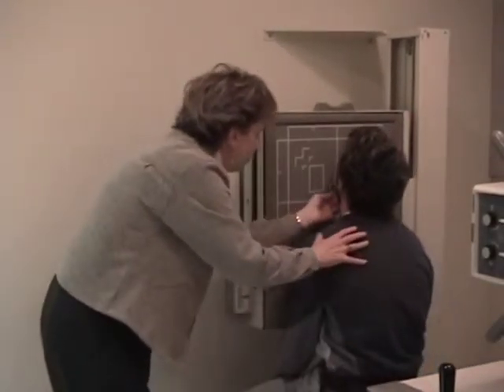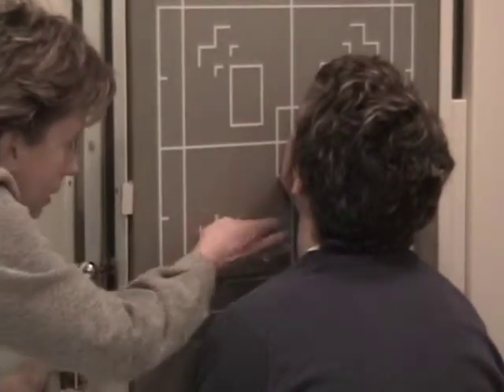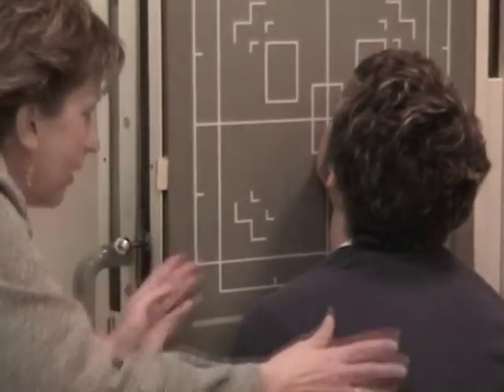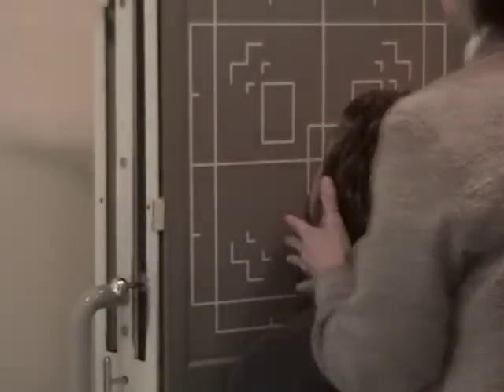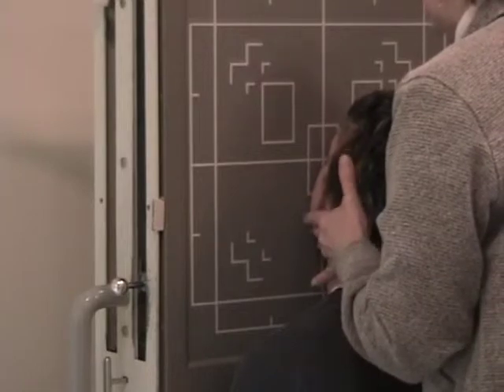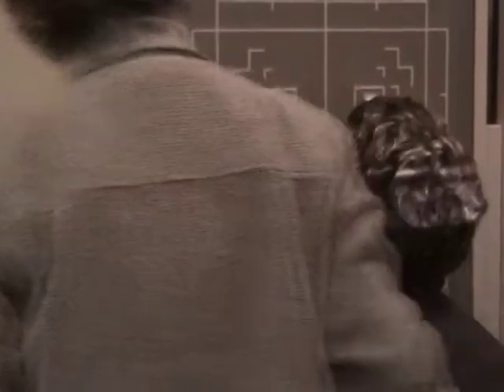Patient will elevate their chin. Till the mental meatal line. A little more, sir. Till the mental meatal line is perpendicular. Exiting to the acanthion. Collimation. Check for MSP that he's centered and that the MSP is perpendicular. And that's your Waters.